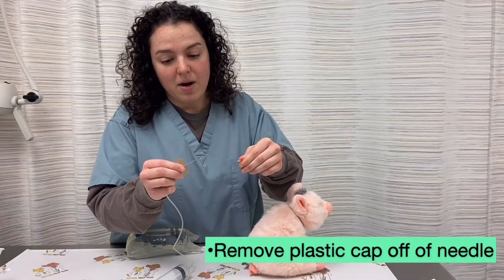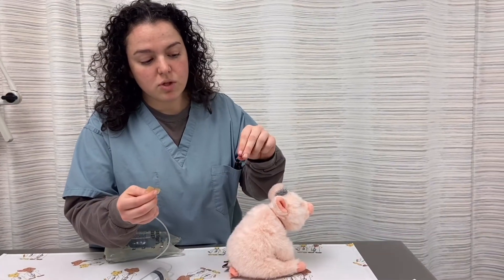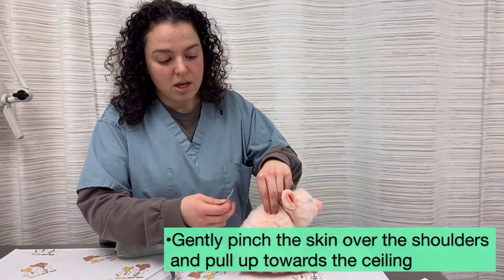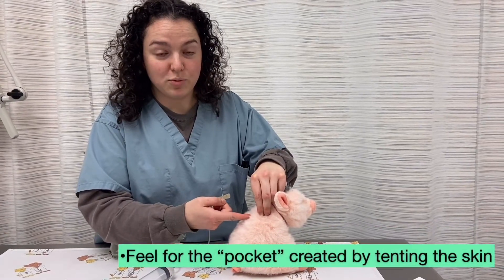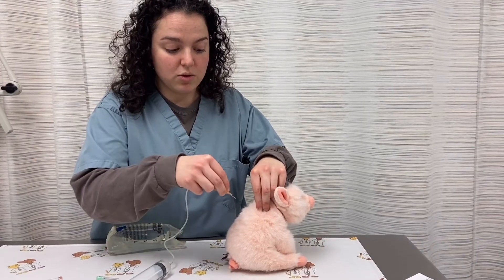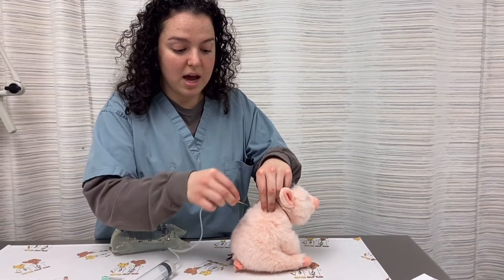Take the plastic cap off the top of the needle. Gently use your first three fingers to pinch the skin and pull up towards the ceiling. You should feel a small pocket between your fingers. Into this pocket, insert the needle. You want to go straight towards the wall, not down, not up.